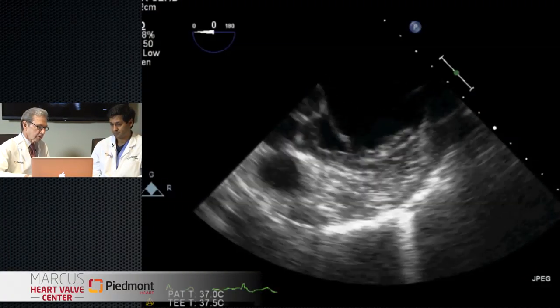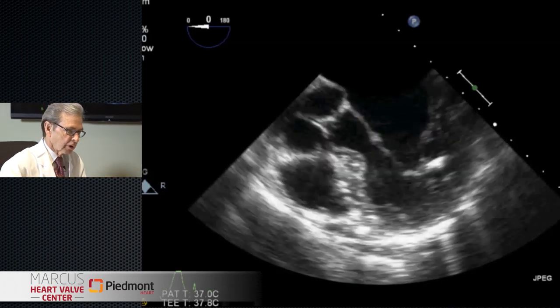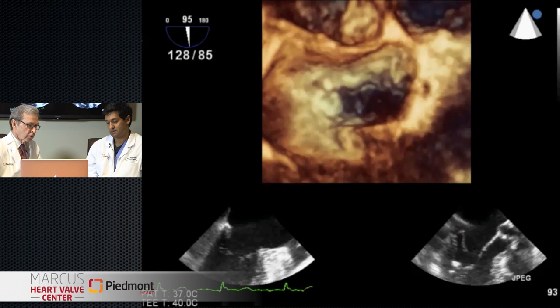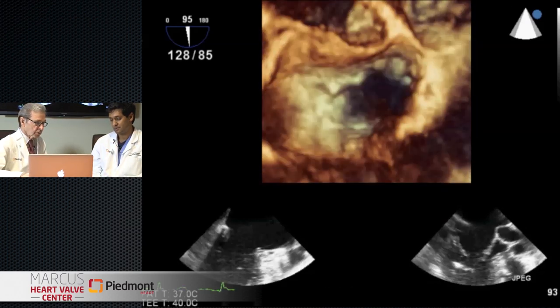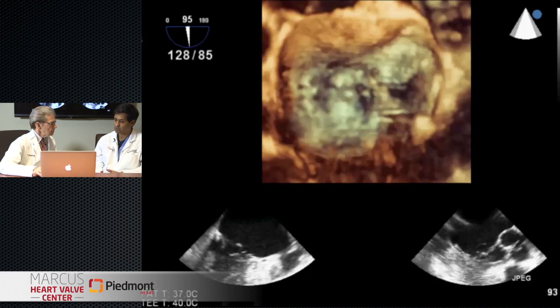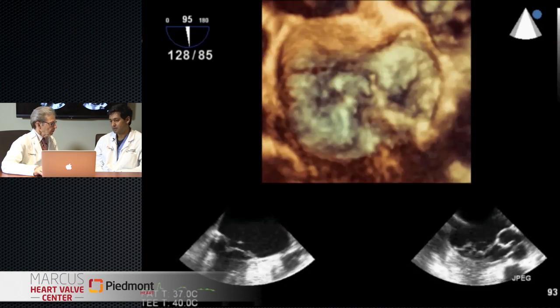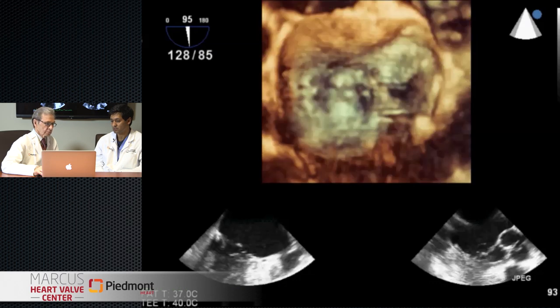This is her transesophageal echo. You've got great views here. It looks like a flail portion of P2 that you can easily see. When we turn on the color, we see a torrential jet of mitral regurgitation directed anteriorly, so we know it's P2. This 3D-TEE view shows clearly P2 prolapsing with that big ruptured cord coming back. 3D is very complementary to 2D, not only in defining the mechanism but in steering our clip and determining our results. She has a central posterior leaflet prolapse - should be a good target for clipping. If we can target that flail segment and secure it back to the other leaflet, I think we can reduce the MR successfully.